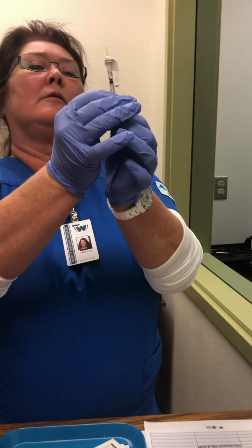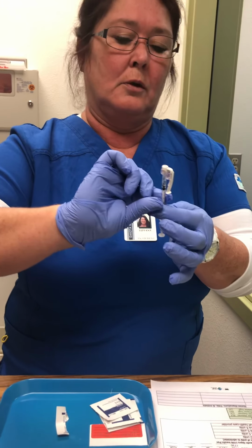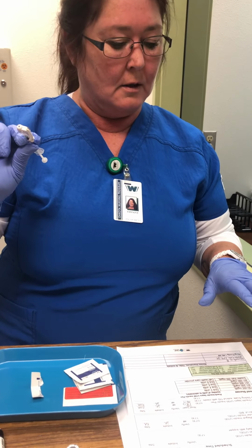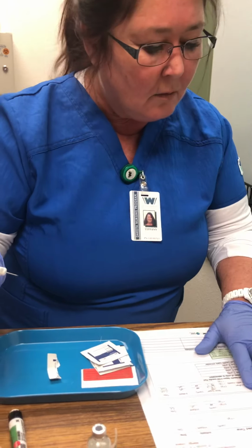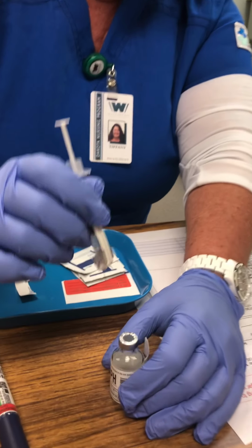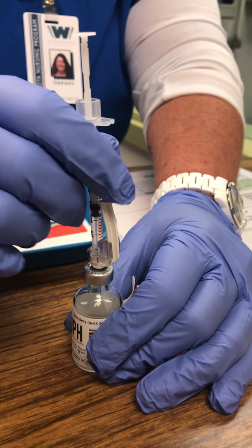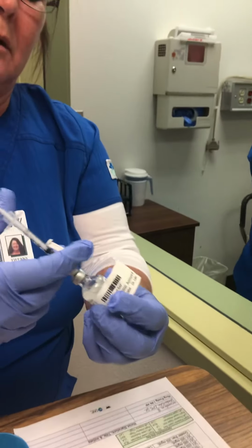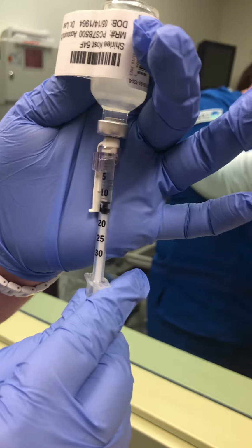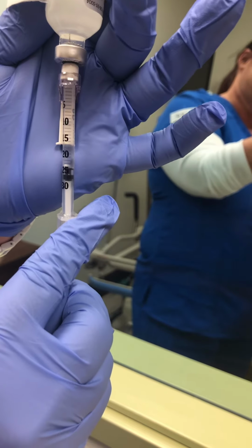And checking, just making sure I have no air bubbles, which I don't. I am now going to draw my 15 units of the NPH, excuse me, had to double check that. And I'm going to be careful not to mix in the vial with the other. So I'm going to place that in, and then I'm going to carefully flip it upside down, and I'm going to draw it back to 25. And I've got my 25.